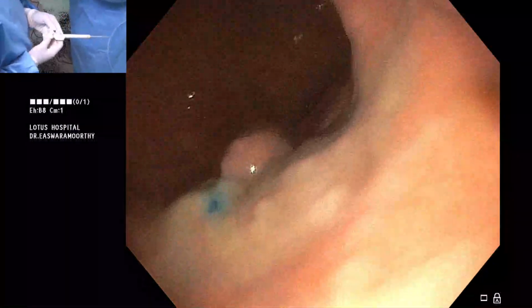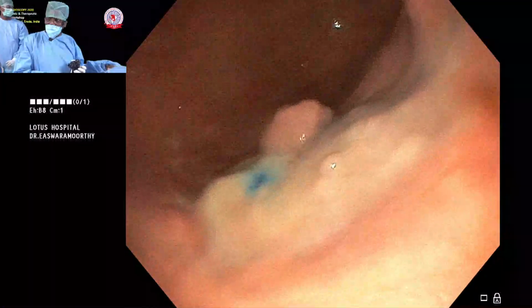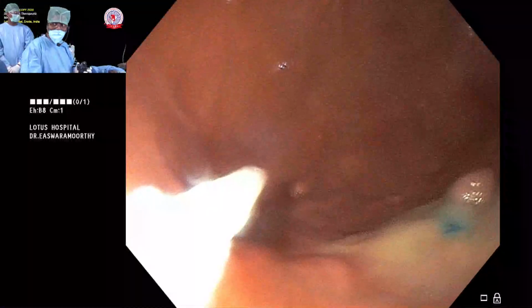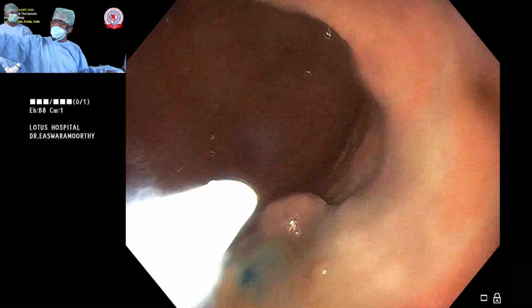I told you we are using an Olympus scope. I know where the access channel is, it is coming around the 7 o'clock position. If I continue the same way, for example, it will go exactly there. See, targeting. I can have a polyp here, I can have a polyp there. But what is ideal is this trajectory. You have to keep any lesion in the lower half of the screen, which is easy to do.